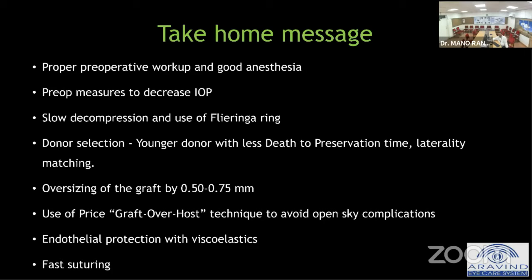In spite of good maintenance of the IOP, you still may have to do very fast suturing, and overall the graft sizing has to be a little bit more, about 0.5 to 0.75 millimeter, and then use liberal viscoelastics to tide over the endothelial damage, which is expected to be a little bit more here.